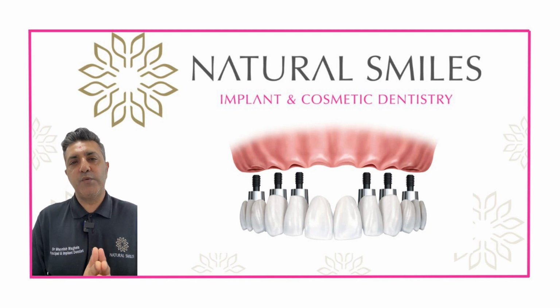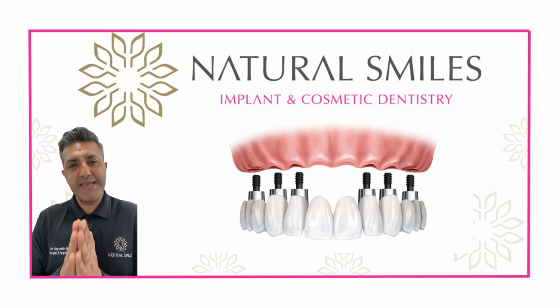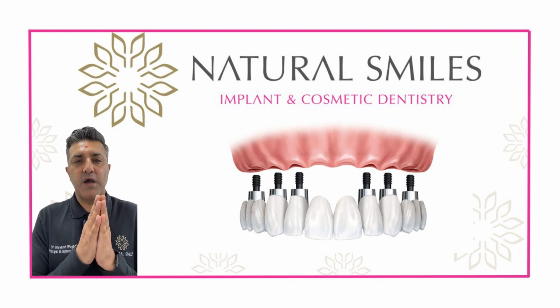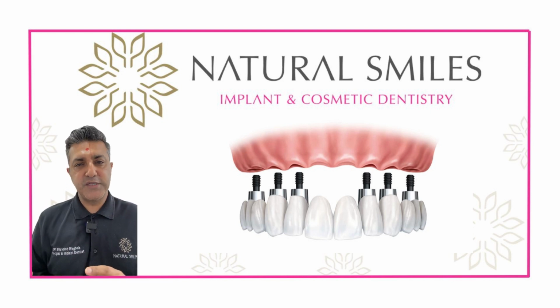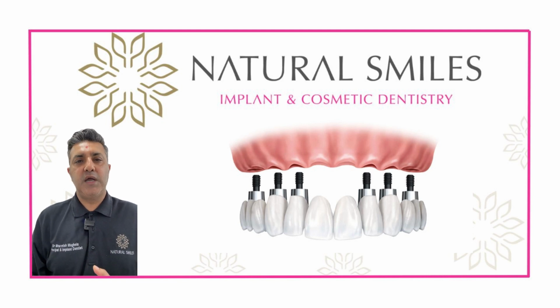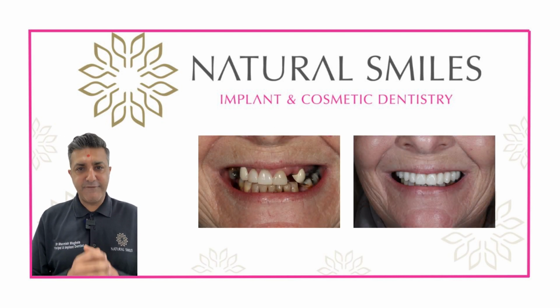And in this scenario, what we're doing is we're giving you a fixed prosthetic one, meaning that there are no artificial gum bits on the bridge. The final bridge or the final set of teeth look a little bit more natural and feel a little bit more natural at the front. But this is not suitable for everybody.